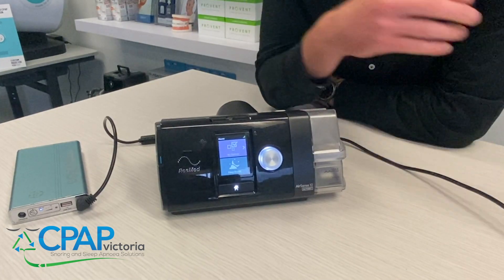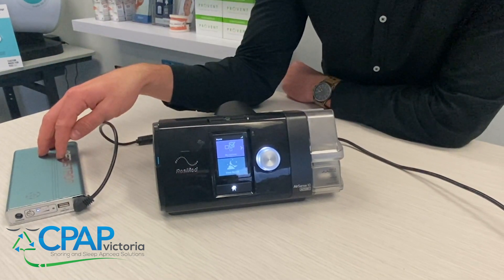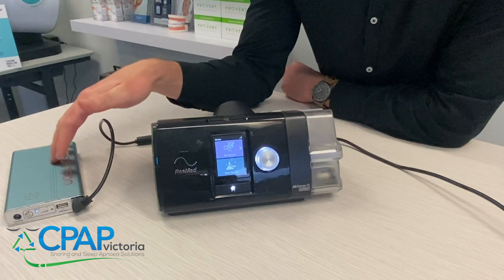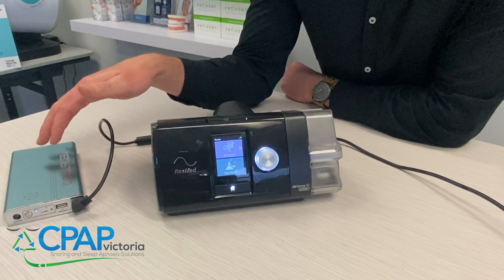There's one little glitch with running the Medistrong power battery: it doesn't have enough power to run the humidifier as well as the machine for the entire night. So if you are going to use just the battery, you're going to have to turn off your humidifier in order for the battery to last the entire night.